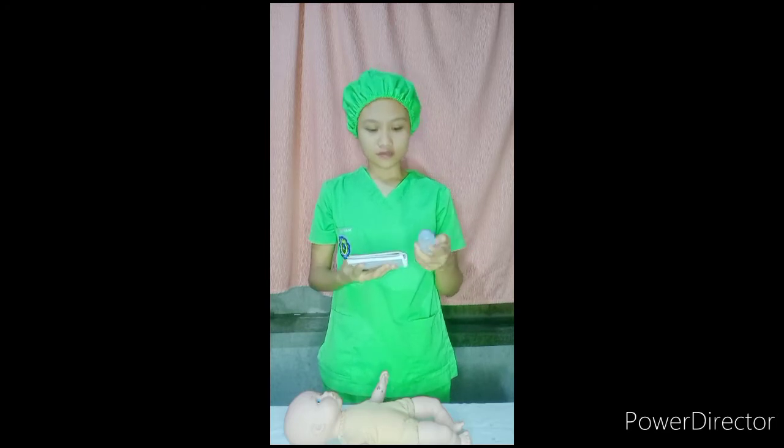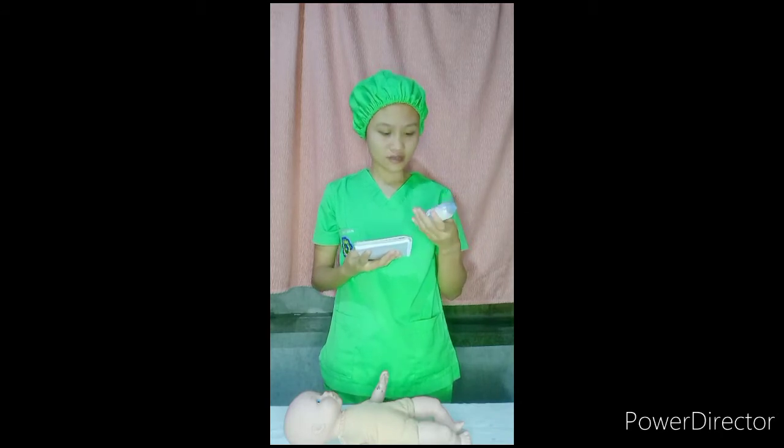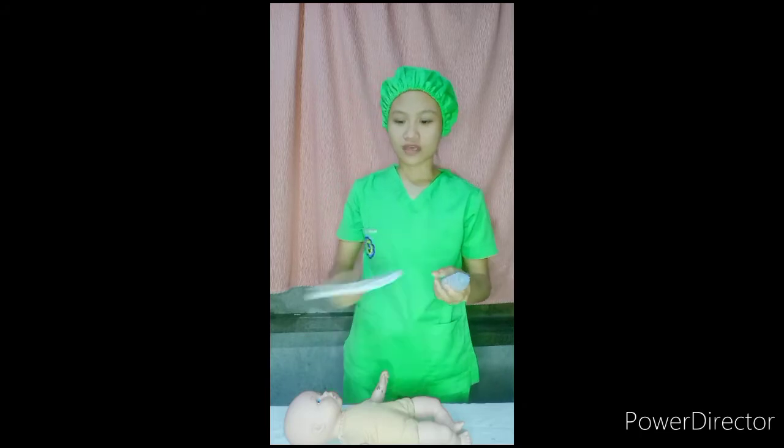Then compare the label with the MAR. Then check the expiration dates and perform calculation if necessary. And if necessary, withdraw medication from a vial or ampule as described in the previous skills.